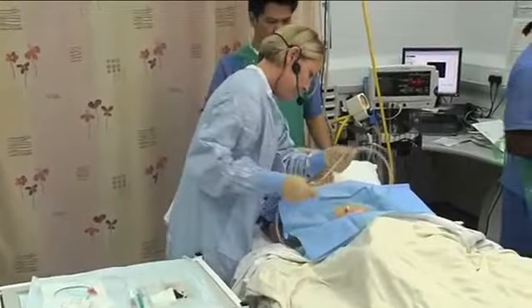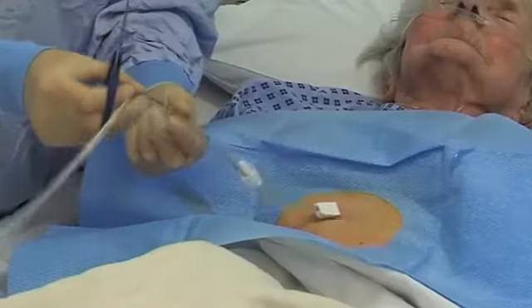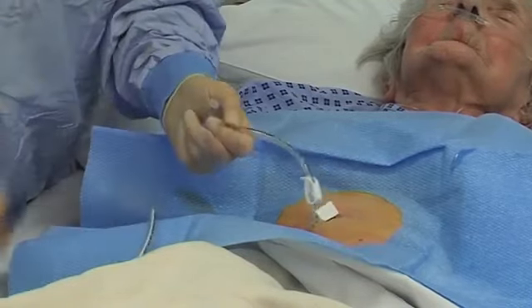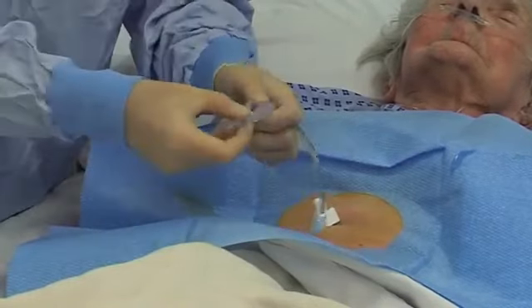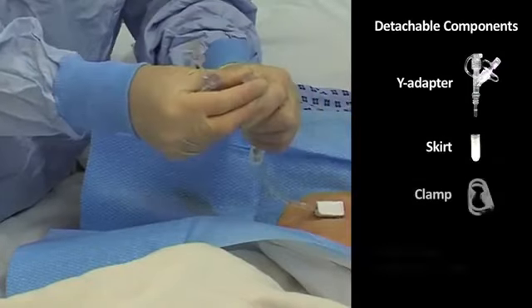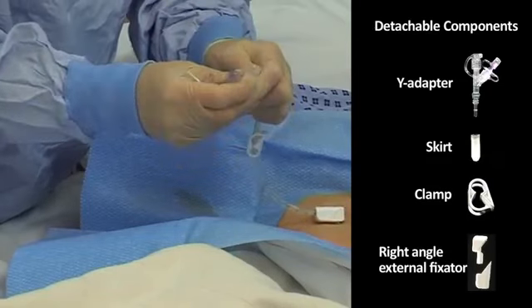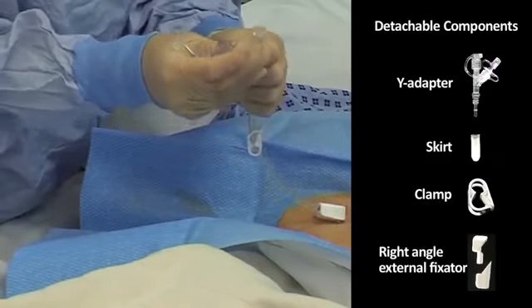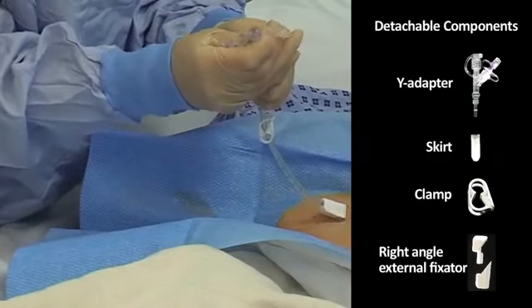So I've got the clamp on, and we tend to cut it here, just before the last bit of writing. And we connect the Y adapter just by unscrewing it, making sure that it is inserted fully onto where the corkscrew starts happening, because that balloon lumen needs to be occluded.